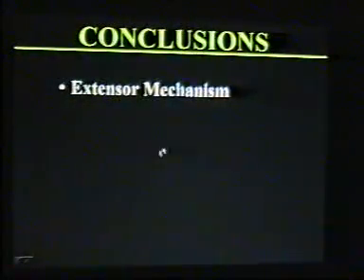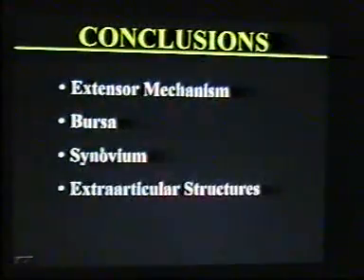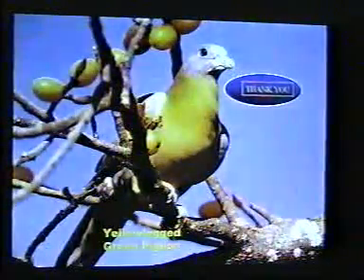So in conclusion, we can say that in knee we can scan extensor mechanism, we can scan bursa, synovium, extra-articular structure, popliteal fossa. Thank you very much.